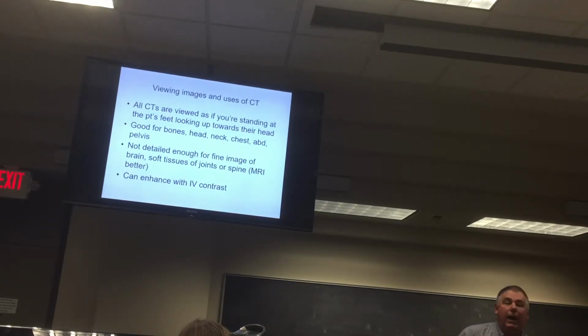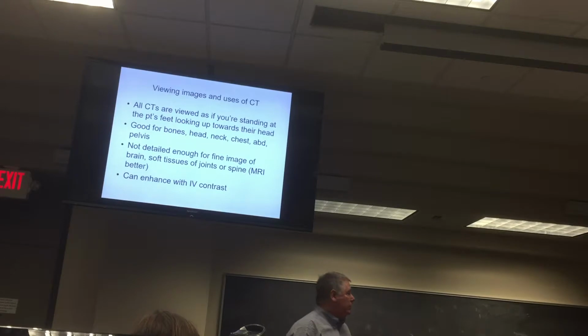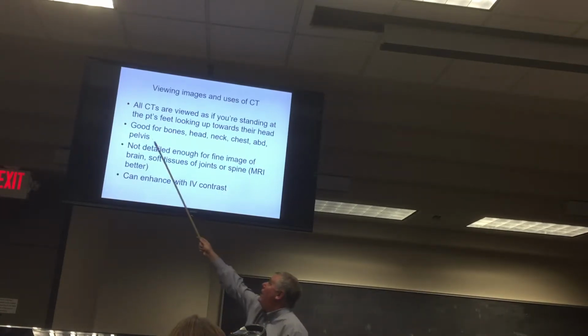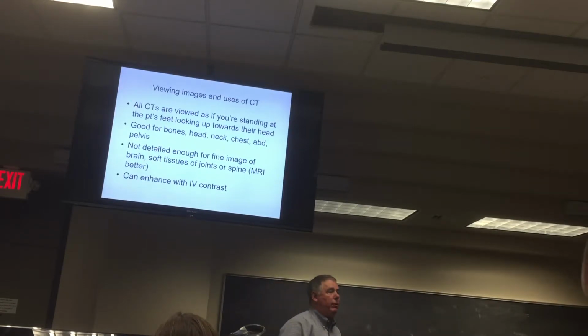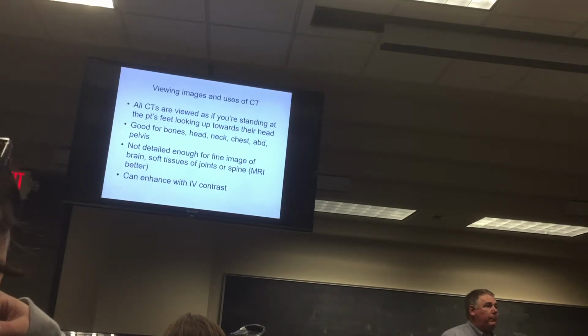The problem with CT is that they're good for things that are going to give you contrast. Like plain films, for the difference between bones and non-bones, and airspace and non-airspace, and contrasted things like that you see here. They're not good on things with the same density. If you're trying to pick out the tendons at the end of a muscle, that's the same density. So if you're looking at a joint, it's great for the bones and the cartilage of the joint, but it's not good for the tendons of the joint. If you suspect an ACL injury, you'd get an MRI. If you suspect a rotator cuff injury, you'd get an MRI. So, okay?